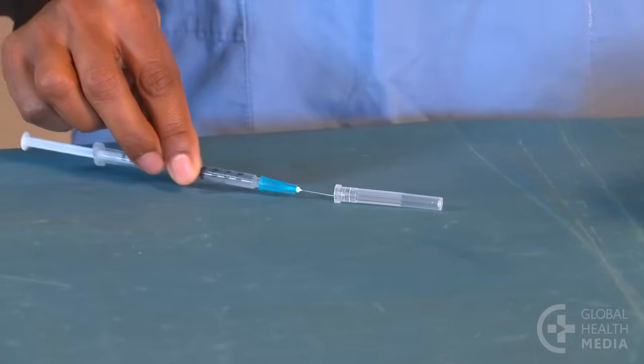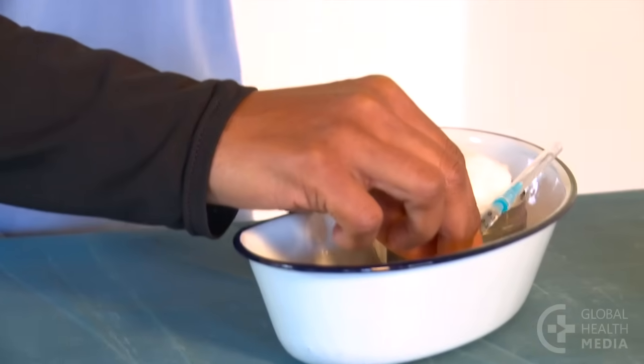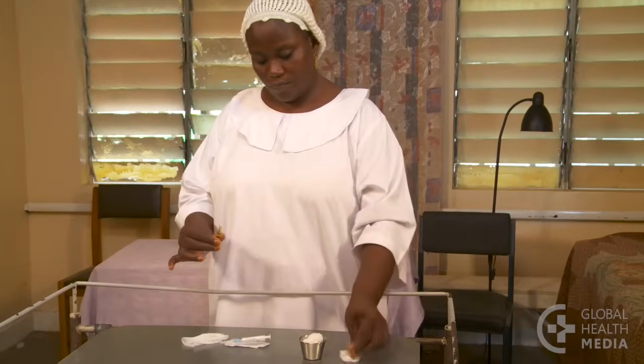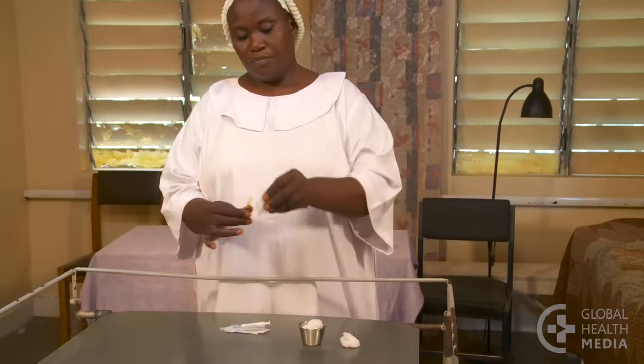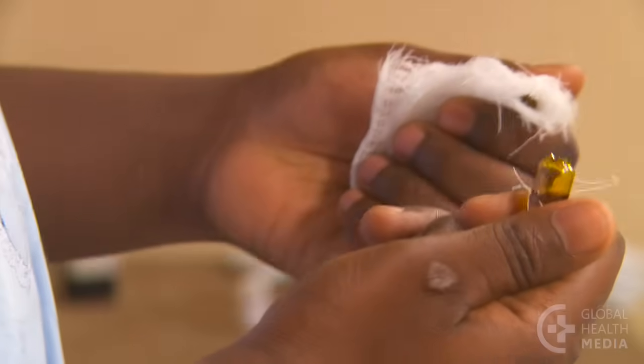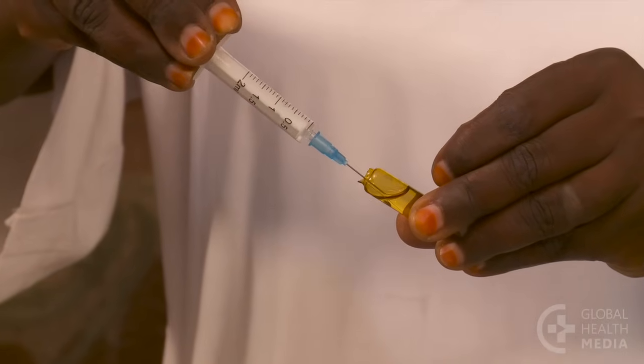Check that you have the right dose of 0.4 milliliters. Cap the needle using the one-handed method to avoid a finger prick. If you are using an ampoule instead of a vial, wrap the neck in gauze to protect your hand and snap off the top, then put the needle carefully into the opening to draw up the medicine.